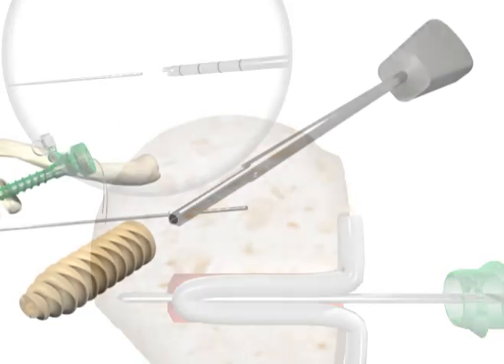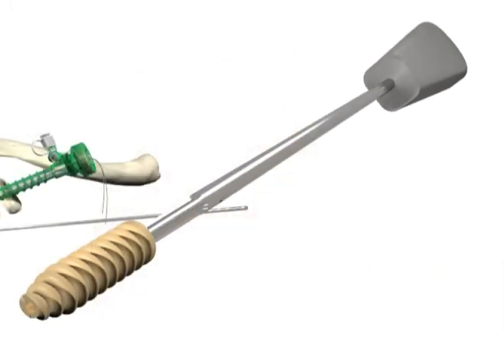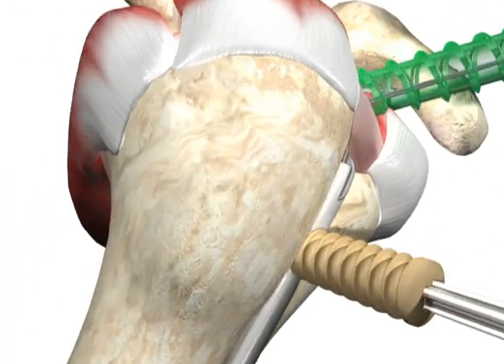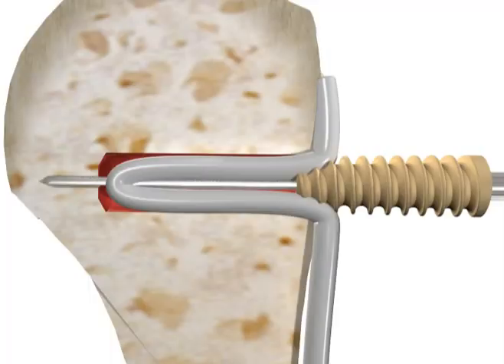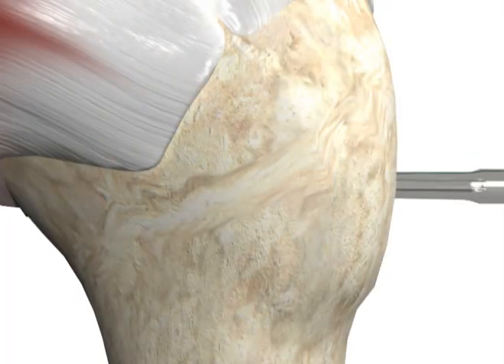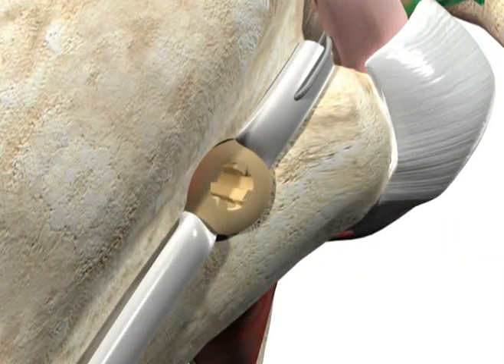Place the Biosure PK interference screw onto the biceptor driver and insert over the 1.5 millimeter tendon pin. Remove the driver and the 1.5 millimeter tendon pin. Reattach the bi-grip pin puller to the end of the tendon pin if you need assistance in removing the tendon pin.